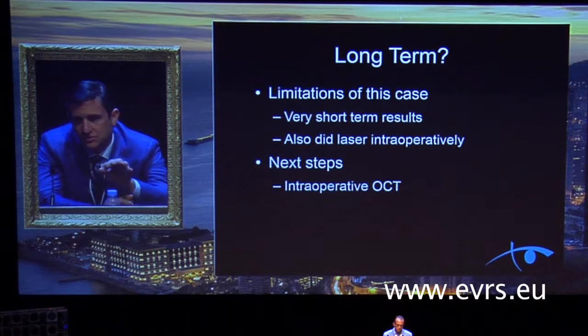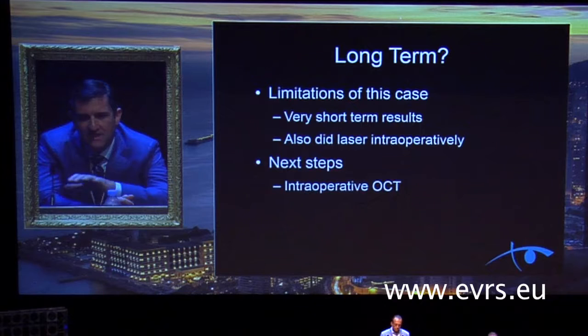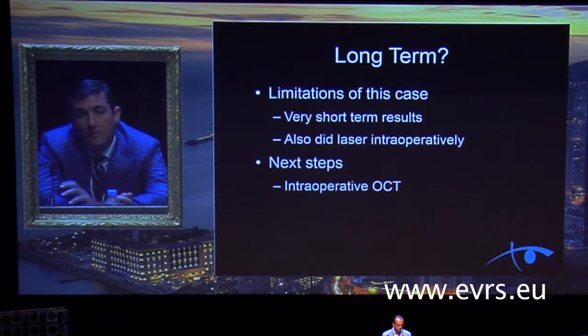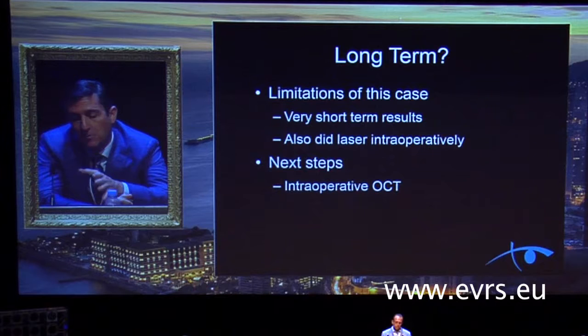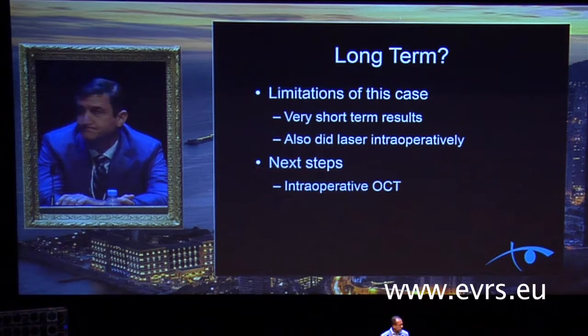We did laser a couple of macroaneurysms intraoperatively, which may account for some of this, although he had that macular edema for a considerable amount of time before, despite other laser. So we'd like to get some intraoperative OCT on this to see if it breaks the cycle intraoperatively and to see maybe how long we need to leave it on for to get ideal results. And hopefully we can use this in some of these intractable cases in the future. It's a pretty scary thing.